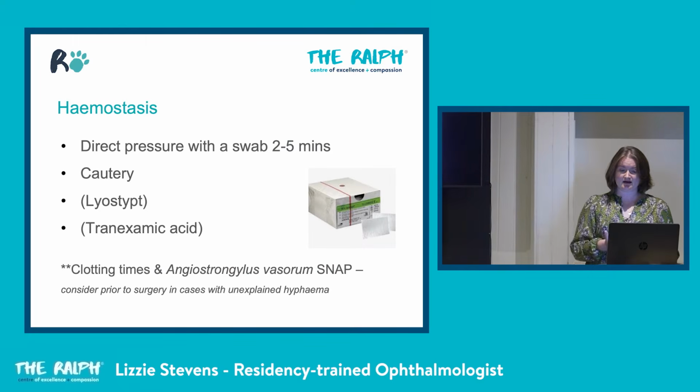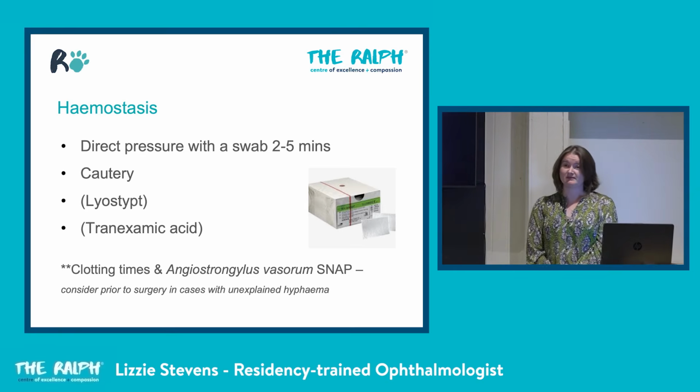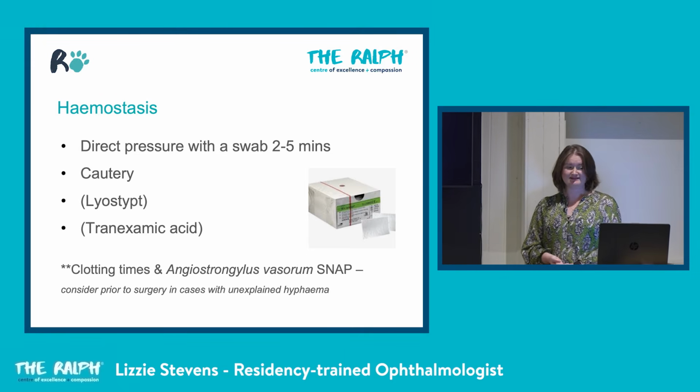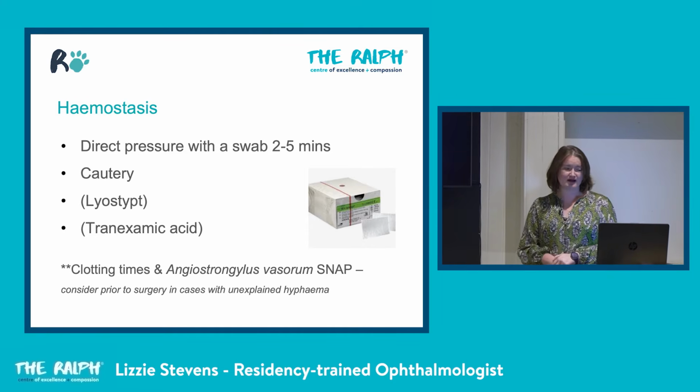And normally once the eye is out, you can do pressure for a couple of minutes, I say up to 5 minutes, and in the vast majority of cases, that is enough. It's nice if you have cautery. I have to admit, I don't use cautery in most cases, but it's nice and reassuring to have it there. And there's probably the odd one where you go looking and you think, okay, I do want to use that.